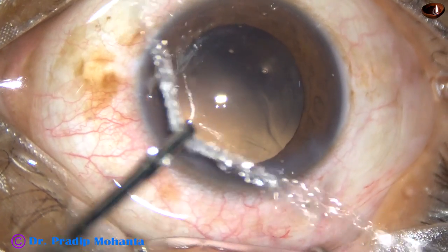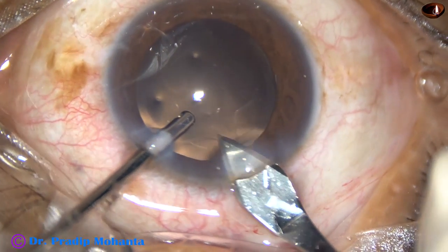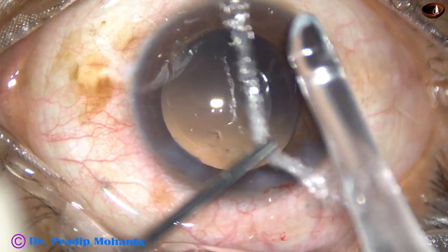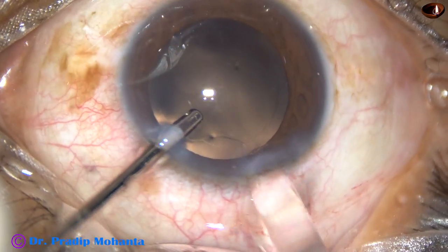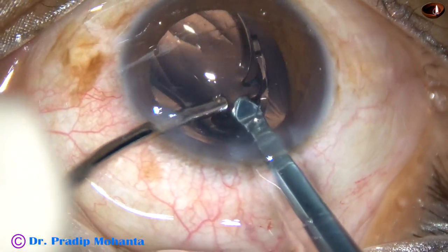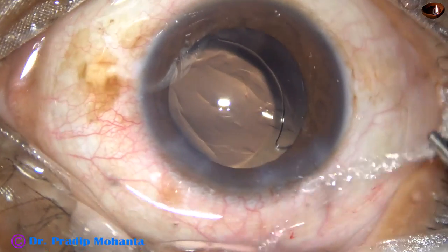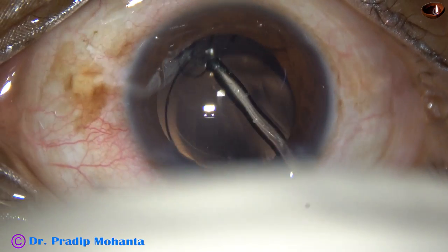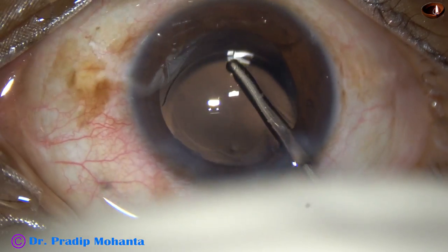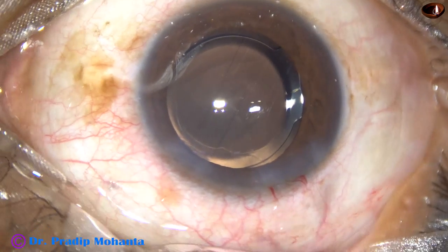Now I implant the lens with an injector. In this case, I enlarge the main wound by 0.2 millimeter, so the wound becomes about 3 millimeters. A monofocal single-piece intraocular lens has been placed in the capsular bag, and the lens is nicely centred.